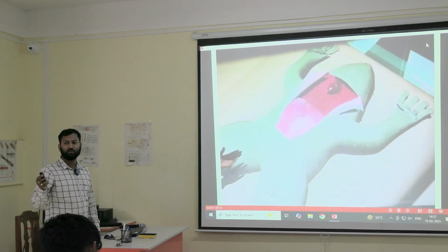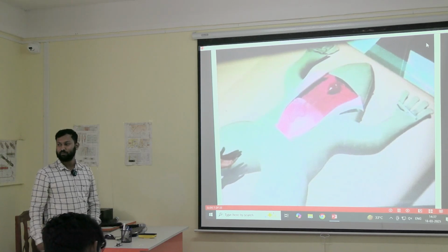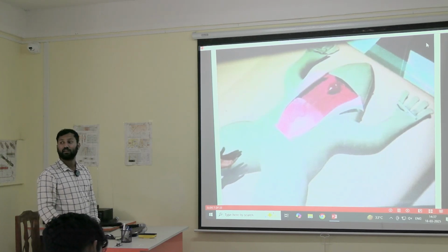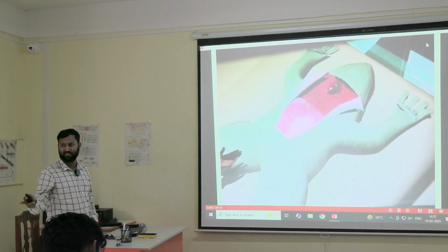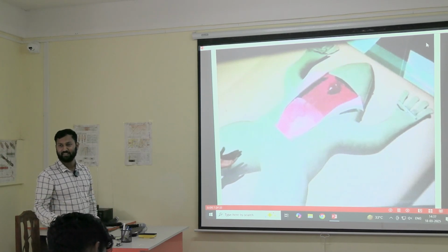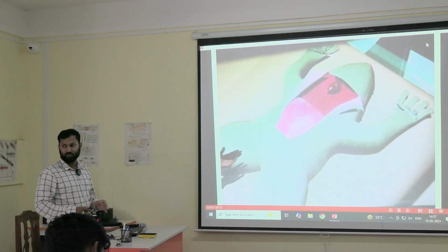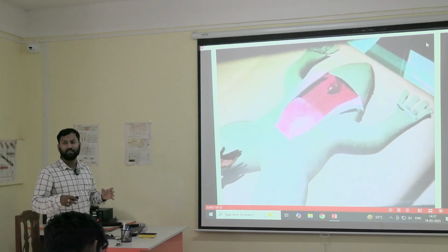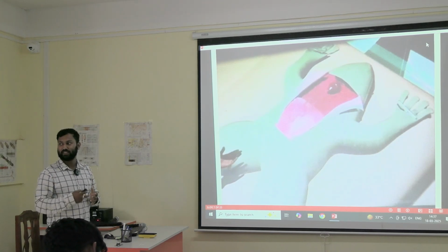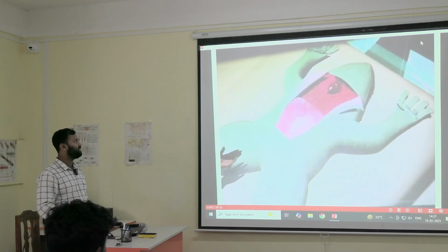After that, we also have to cut out the pericardium. What is the pericardium? Can anyone tell me? Explain in such a way that I can understand, I can listen. Okay, it is the outer layer of the heart. So we are slicing it out so that we can reach the heart, and we can try different types of drugs so that it can reach the heart and it can show its effect. So we are exposing the heart.